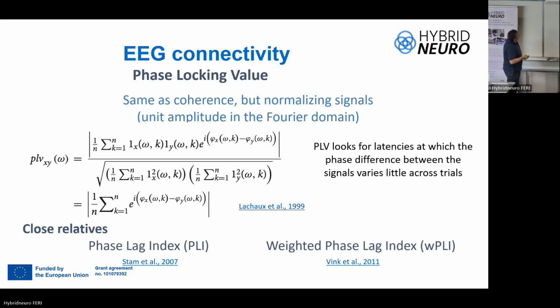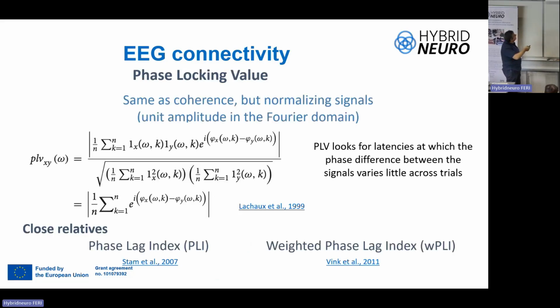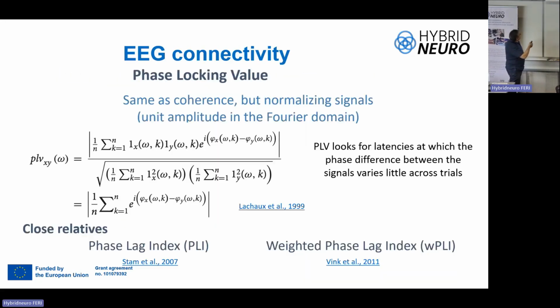In the phase lag index, there is an article with a nice explanation, but the phase is only considered, as I mentioned before. For example, you can represent the phase of any complex number, because remember that here we have a complex function.